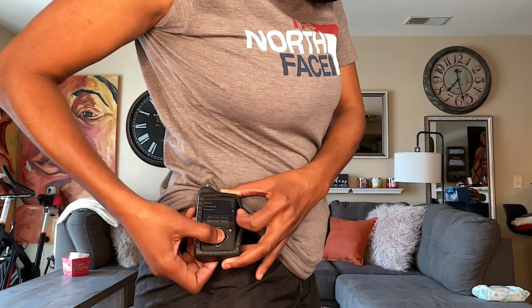It takes about 2 hours to warm up. That is how long it takes for the signal to connect to my pump and for my blood sugar numbers to start showing on my pump.